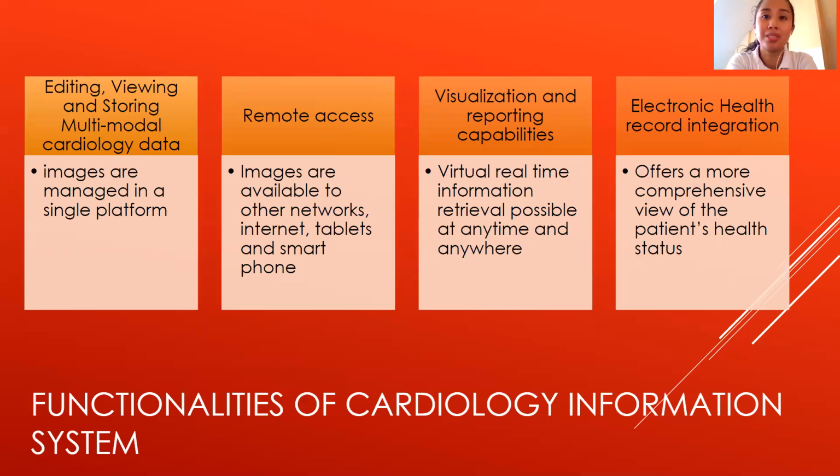There is so much, may mga memes. In single platform, you can do so much thing. Same thing with your CIS. So you can do so much thing with your cardiology-centric images. You can have remote access, you could access it even though you're far away.